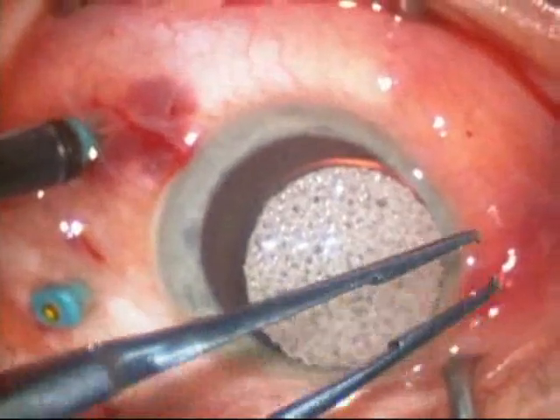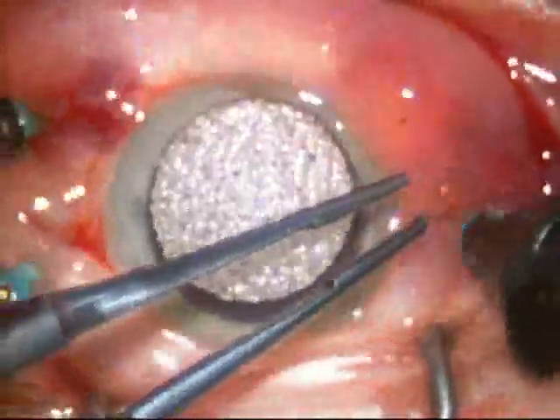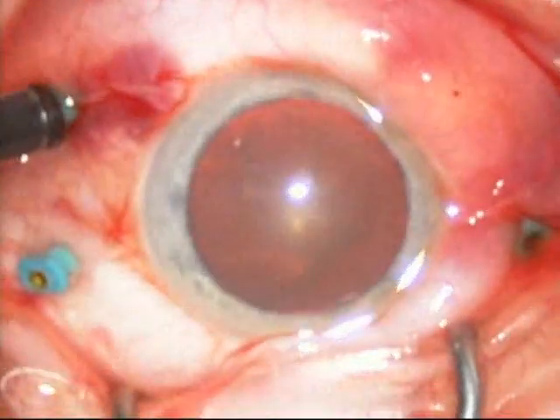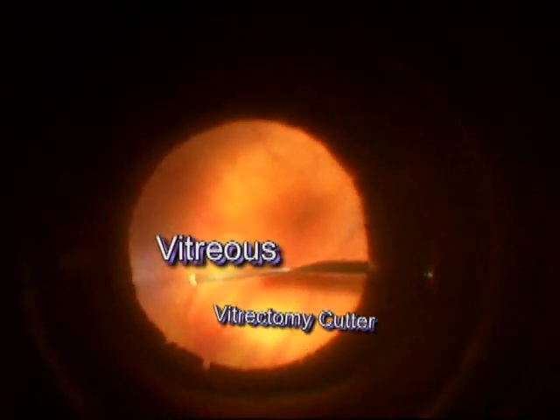This surgery is being done under local anesthesia with sedation. This particular macular pucker is a very fine macular pucker and it's virtually invisible at the beginning of the case.